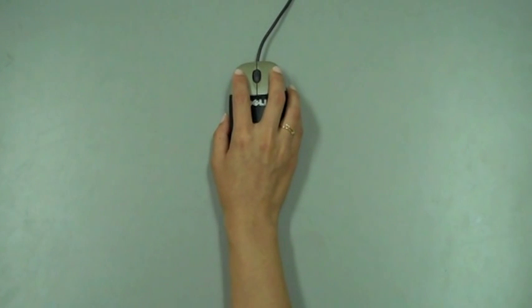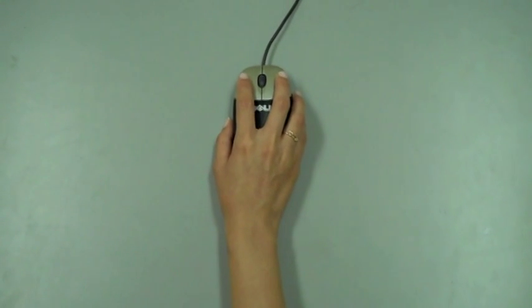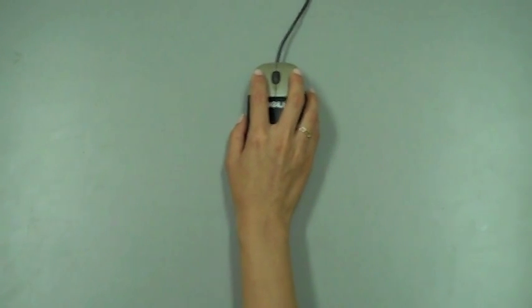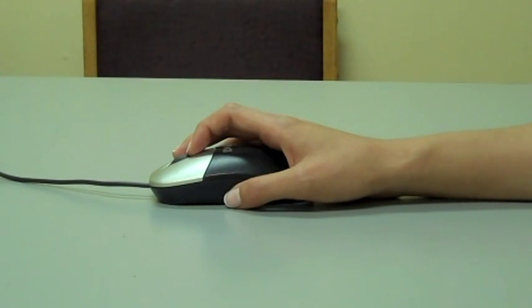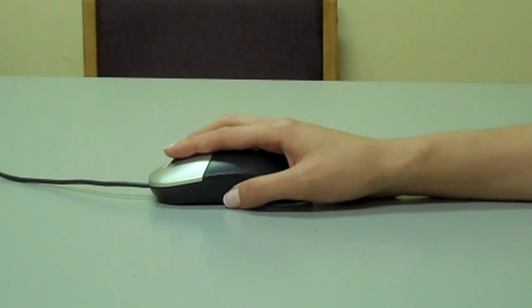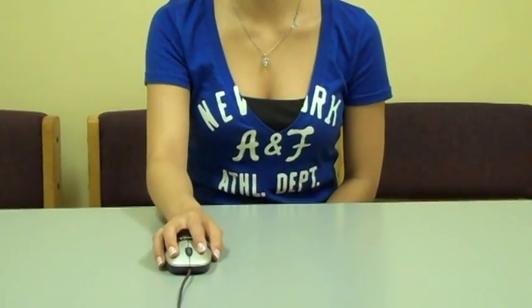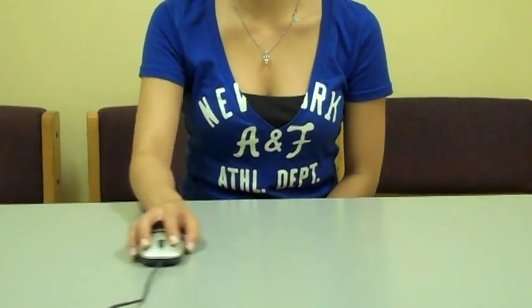Now let's have her navigate the mouse and notice the movement of her wrist and fingers. As you can see, the wrist remains in the extended position with minimal radial and ulnar deviation. Let's have her use the scroller in the middle of the mouse to scroll up and down. Notice her second digit is flexed as she scrolls downward and is extended as she scrolls upward. Looking at the front view, notice her movement at the elbow and shoulder. The standard mouse requires more movement of the upper extremity.